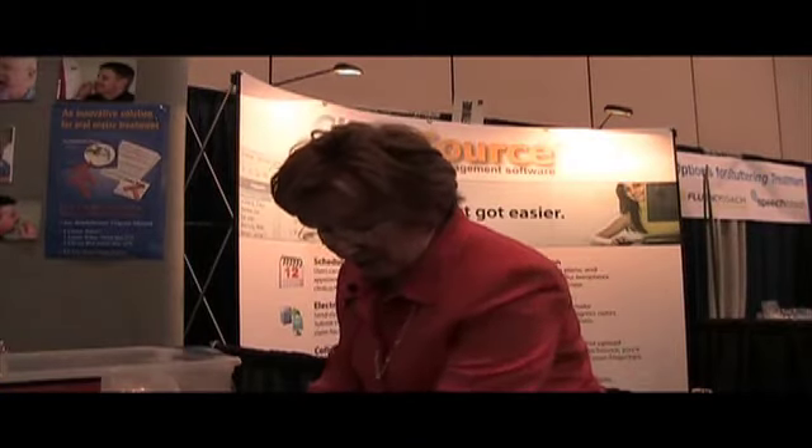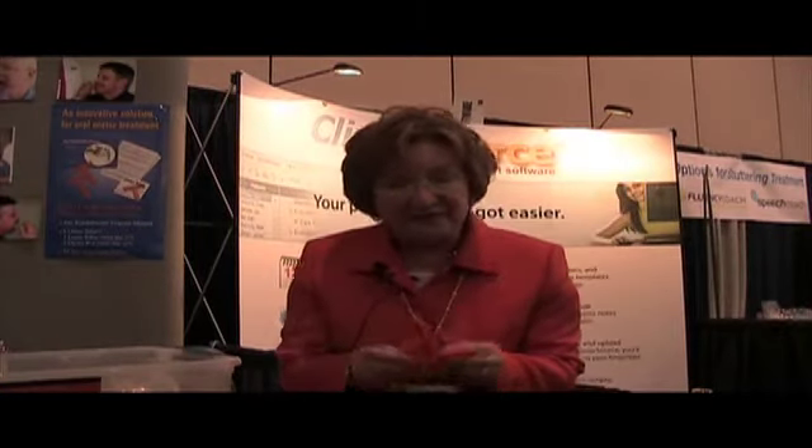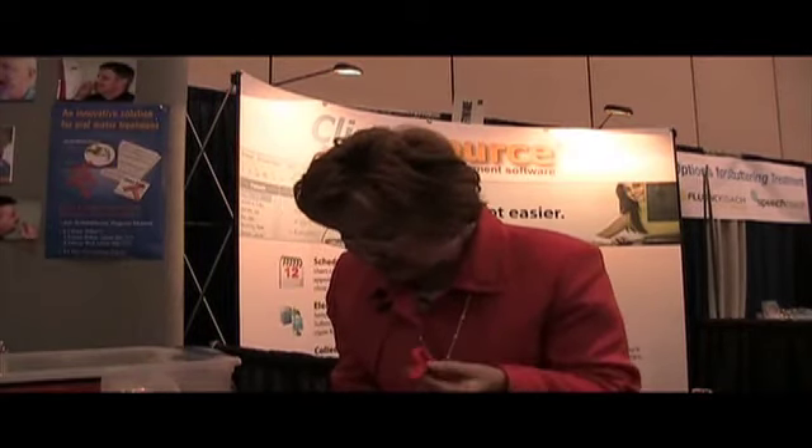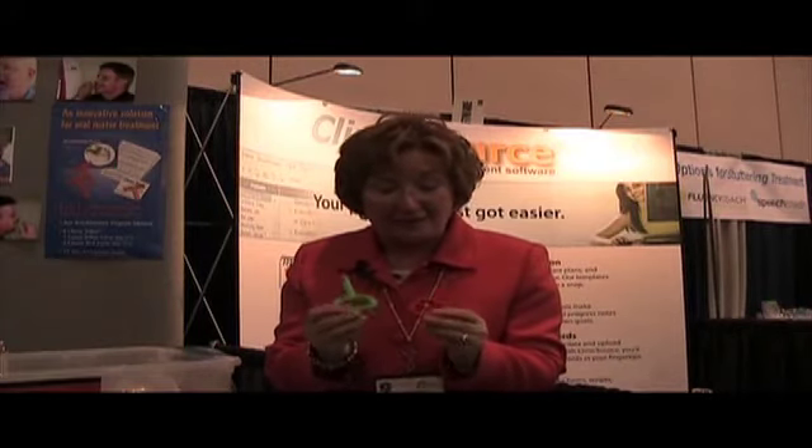In our product line we also have P's and Q's, which are solid tools for biting and chewing. We also have the red Super Chew and the green Super Chew — these have handles which are easily grasped with little fingers.